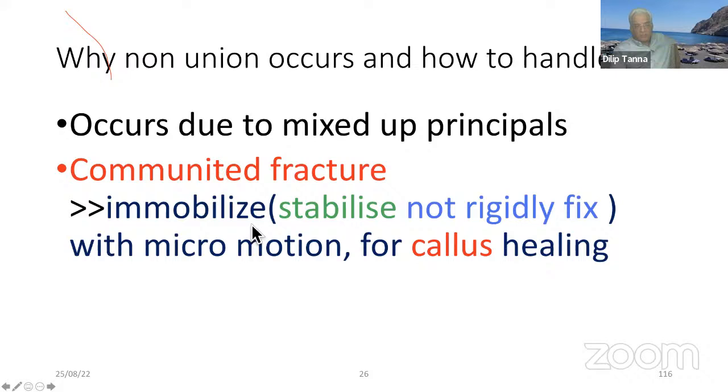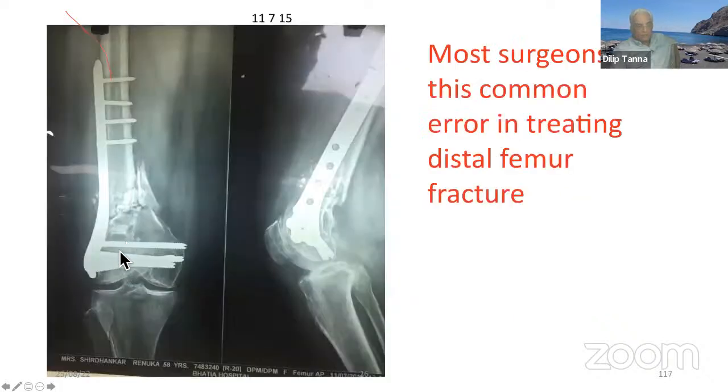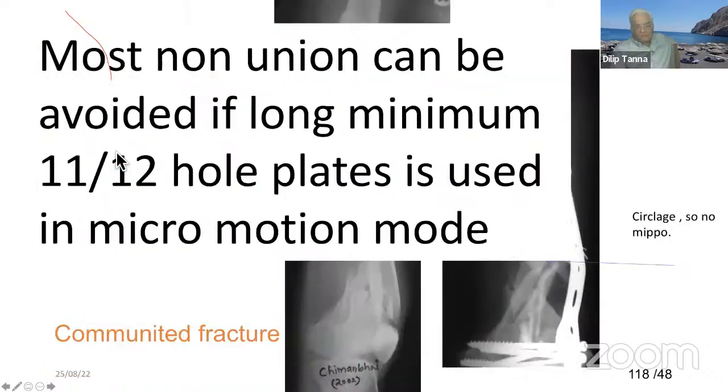Comminuted fracture: immobilized, stabilized, not rigidly fixed, with micro motion for callus healing. Spiral fracture: lag screw and rigid fixation for primary healing. As you can see here, one of my colleagues, a fellow surgeon, made this common error in treating this distal femur fracture. Comminuted fracture, short plate. Such non-unions can be avoided if a long plate, minimum 11 to 12 holes, is used in a micro motion mode.